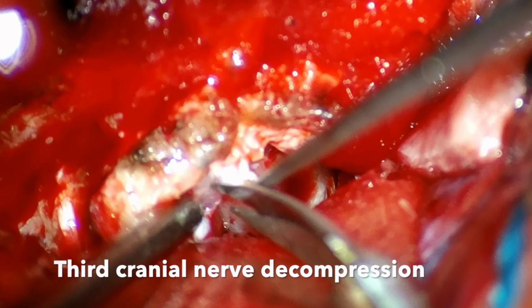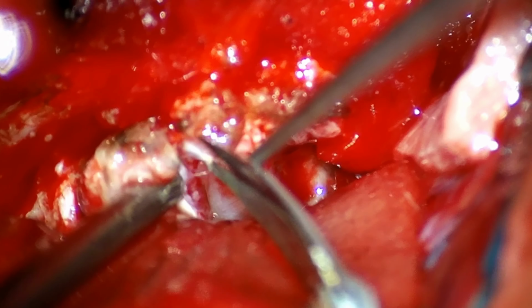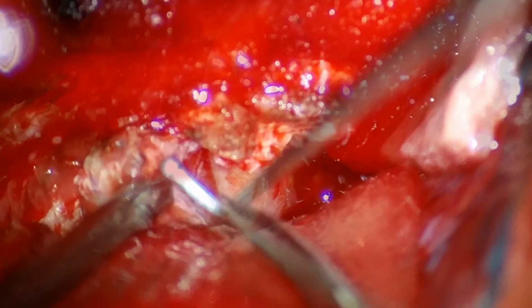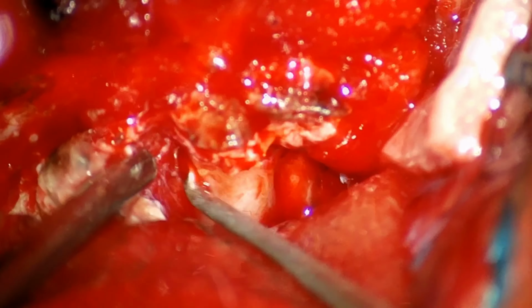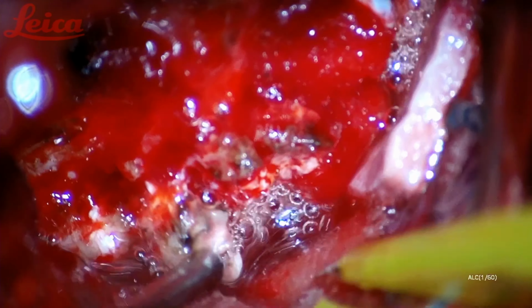Section of the oculomotor triangle is done in a posterior to anterior direction, being careful with the lateral extension to avoid injury of the fourth cranial nerve that runs in the lateral wall of the cavernous sinus. Coagulation of the cavernous sinus is minimized, and bleeding from the cavernous sinus is controlled with gentle pressure over a Gelfoam patty and warm irrigation if needed.